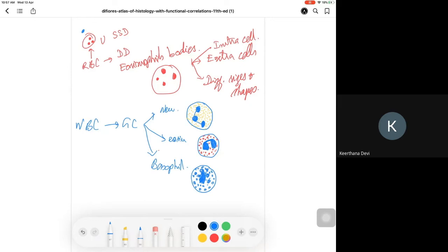histopathology. In histopathology, the eosinophil won't show this much of granules, okay? It will show 2 lobes, and it will be more like a fuzzy eosinophilic cytoplasm. You don't see the granules. And then we are coming to agranulocytes, which are divided into lymphocyte and monocyte.